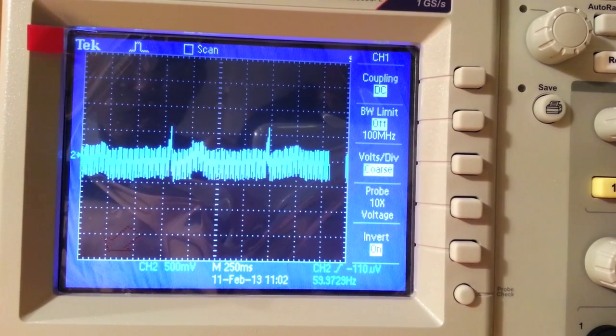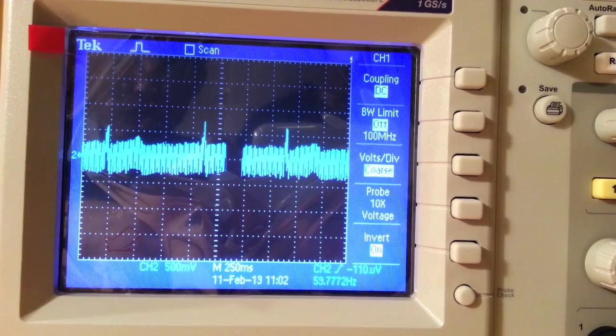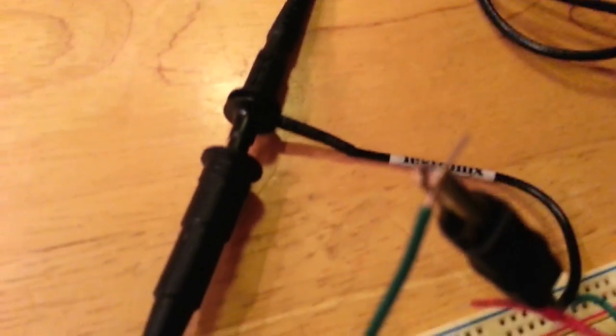We are now going to take a look at the ECG circuit in action, with the output being displayed here on an oscilloscope. Although individual wave complexes can be seen, this output is still quite noisy because it is pre-DSP, meaning that it hasn't been filtered.